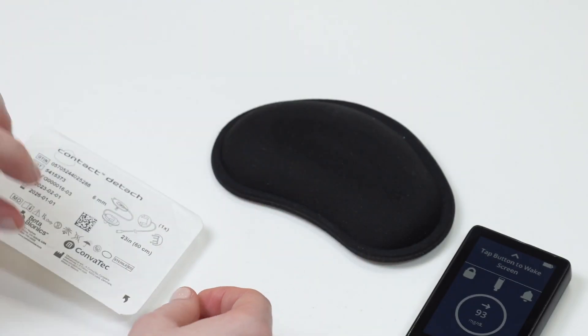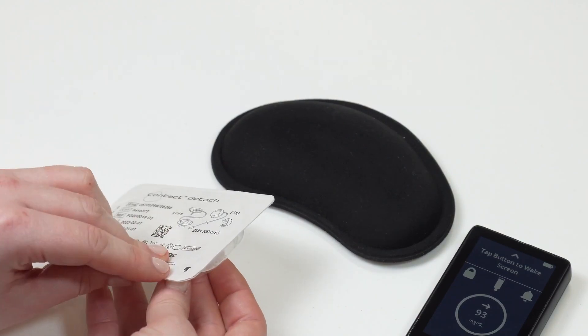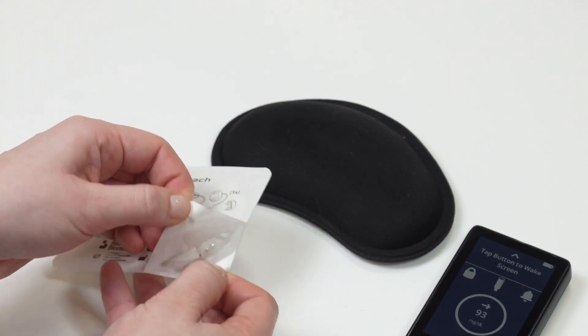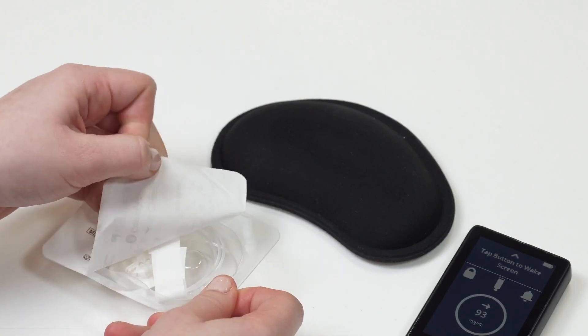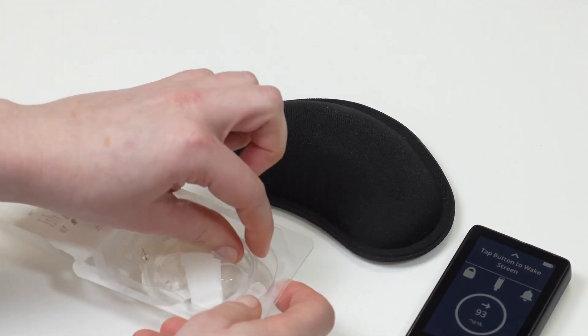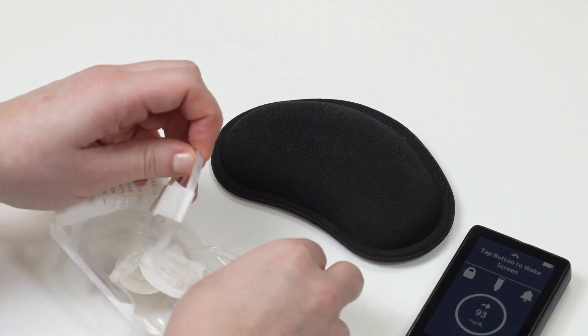Open your infusion set package by pulling on the white tab in the corner. Your contact detach infusion set comes in two pieces: one has long tubing and one has short tubing. When you are changing just your infusion set, you only need the short piece of tubing. Discard the long piece.